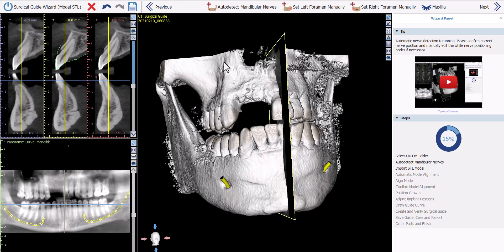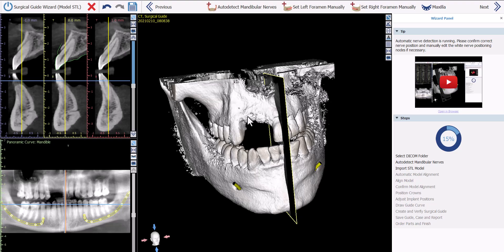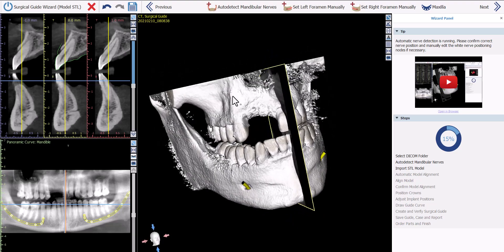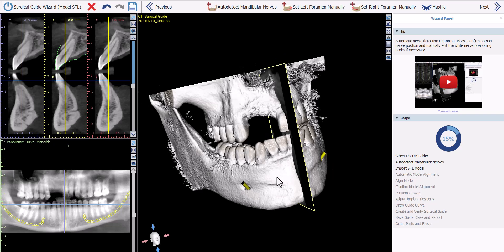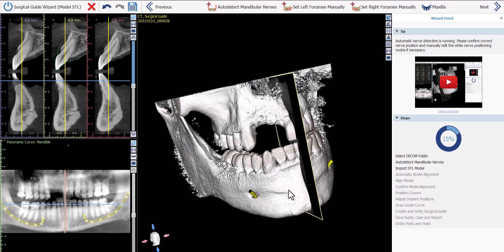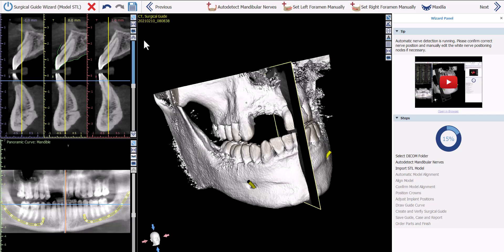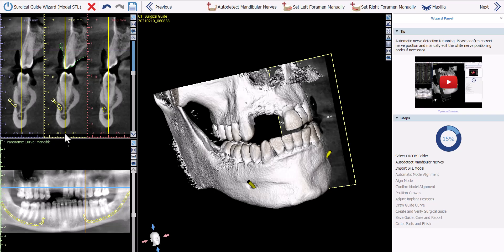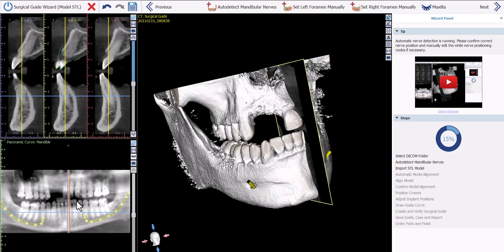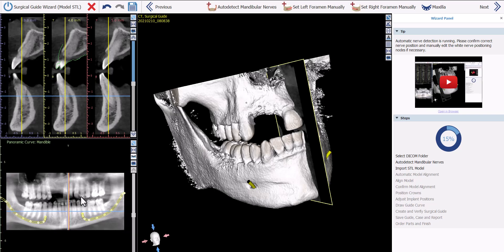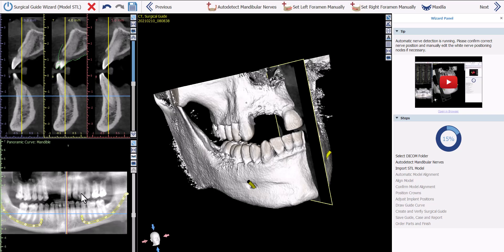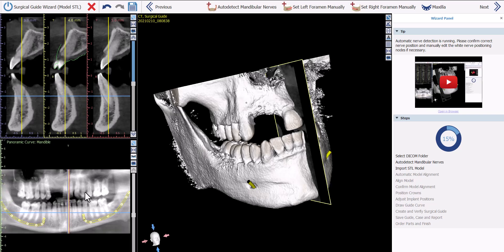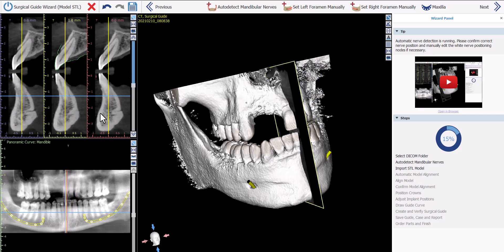A word about mouse control throughout the software: use the left mouse button to grab and rotate any surface in the 3D view. Use the right mouse button held down and move the mouse backwards or forwards to zoom in and out. Hold down the wheel of the mouse to grab and move objects in the 3D view. In 2D views, left clicking a location makes it active and updates other views. Scrolling the mouse wheel goes through relevant slices.